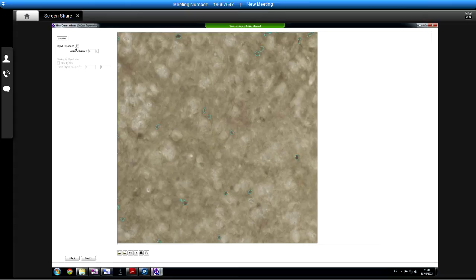What that would do is, if you imagine highlighting one object and eroding the edges down and down and down, the principle being that by eroding the edges of two circles like that, you'll get to the centre of each of them. What you then set here effectively is the distance between those centre points.